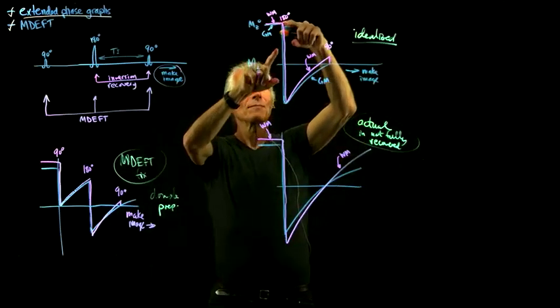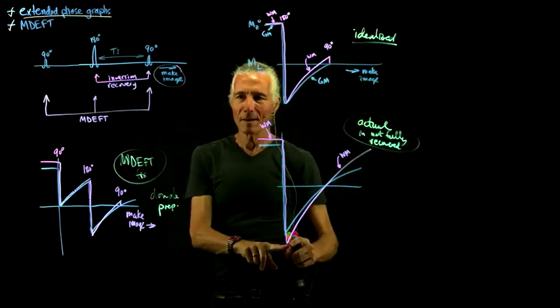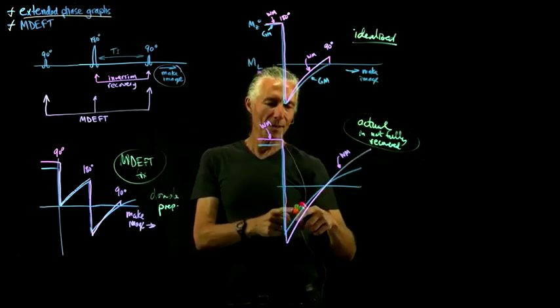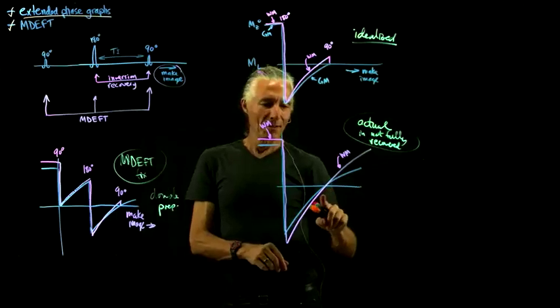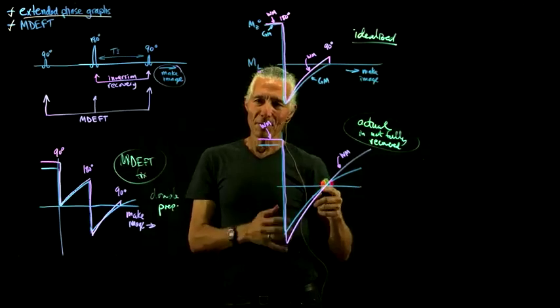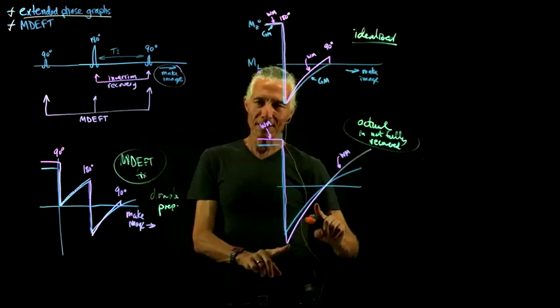So the problem is if we don't wait long enough, then what happens is we're going to start off with a difference between them as they recover, and then given the general scale of these curves, when one of them is crossing zero, the other one is going to be sort of crossing zero because the white matter is recovering faster.